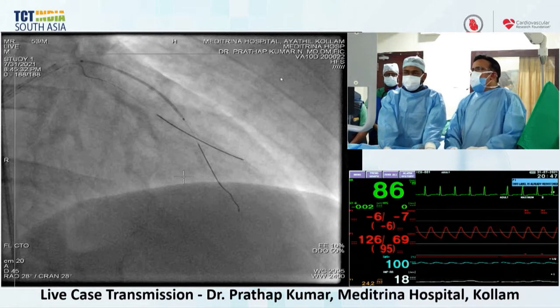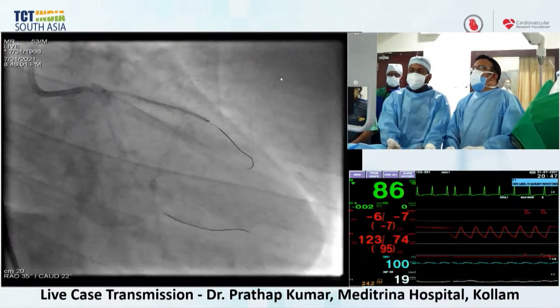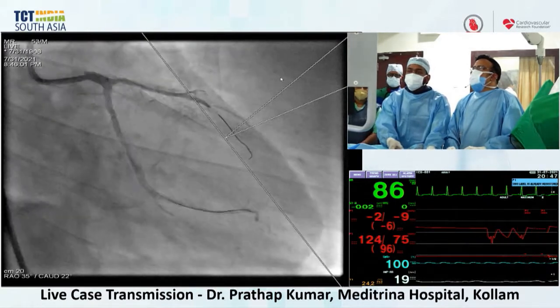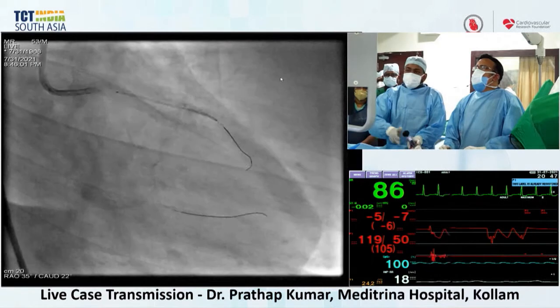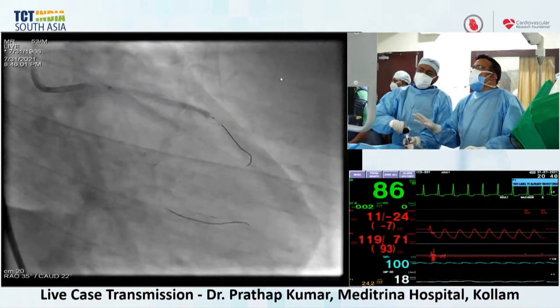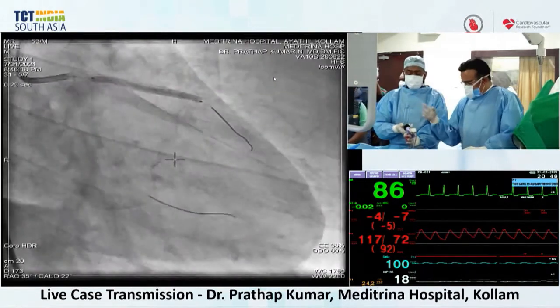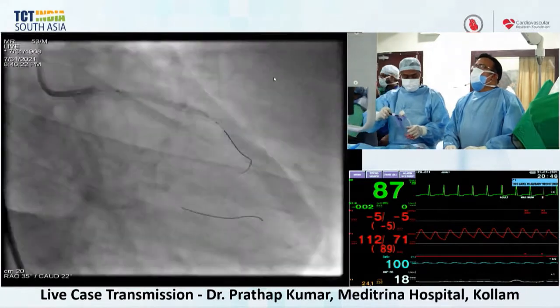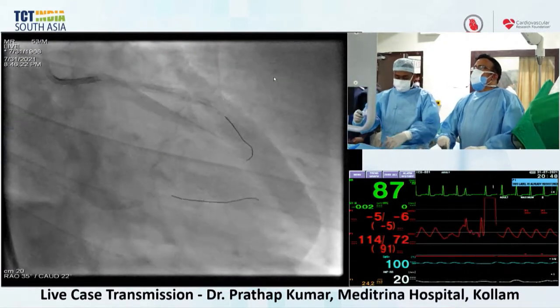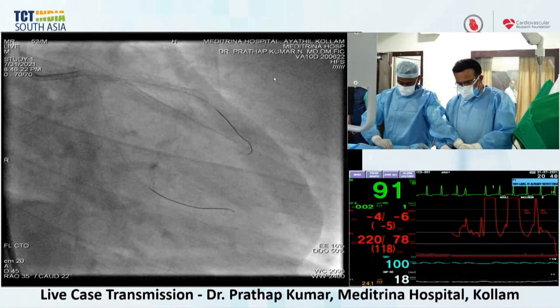So that's sort of where I was going as well with the flip to antegrade. I often flip my retrograde systems to antegrade, but I keep my retrograde guide in place, because I would rather put the balloon up in the antegrade segment towards the distal cap and plug the CTO vessel and take a retrograde injection to prove that you've got a good healthy distal vessel. Then you do the opposite of instrumenting the donor vessel, because at that point you're instrumenting the non-diseased vessel instead of the one where you're going to end up stenting anyway.